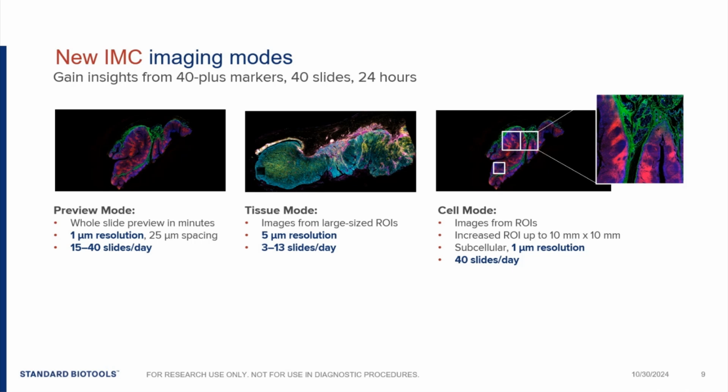All of this, the spatial context of where the signal is actually present within the tissue or within the cell, is extremely important for answering your biological questions. Depending on the size of the region selected, this imaging mode is on the order of minutes to hours for completion.